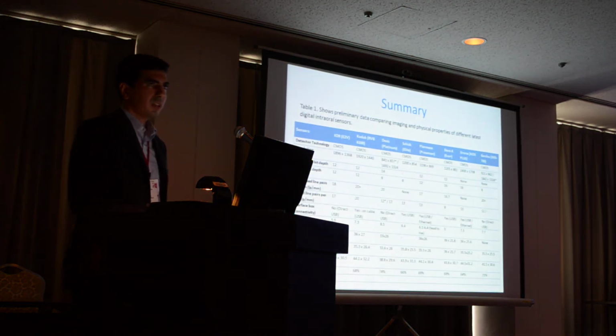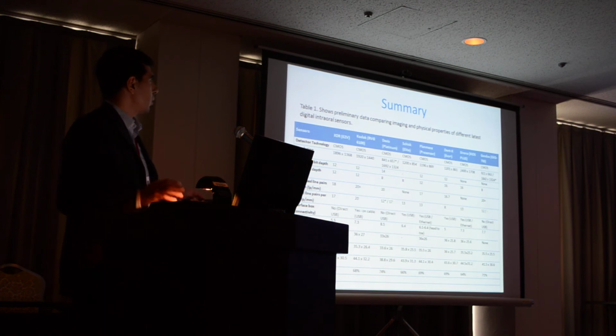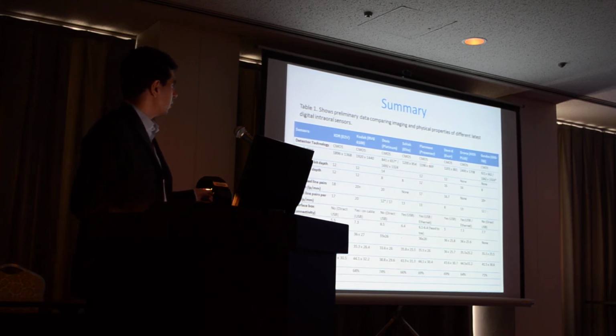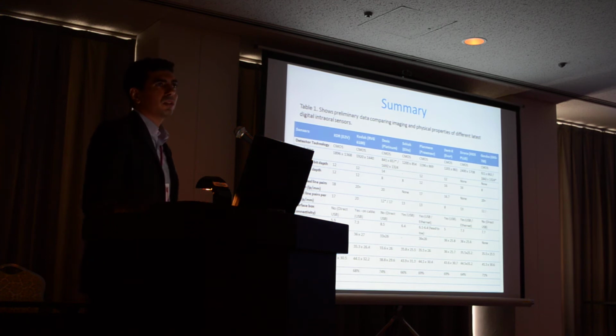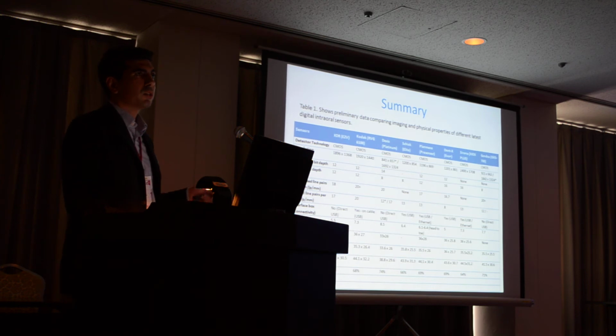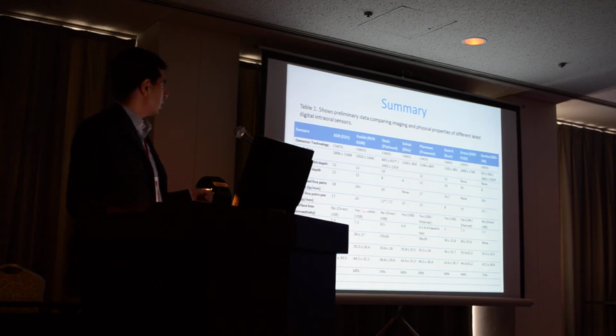So what we did is that we formed a table, a summary of our findings, and on top, on the columns you see the sensors, and on the rows you see different specifications. And as you can see, the highest resolution was probably for the Kodak sensor. Dexis sensor was of particular interest because although they say the sensor is 2.2 megapixels, by default they set it to 0.5. And unless you go and change that, you basically take images at a much lower resolution.